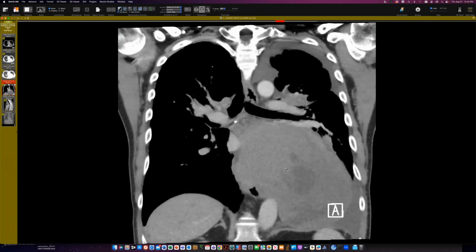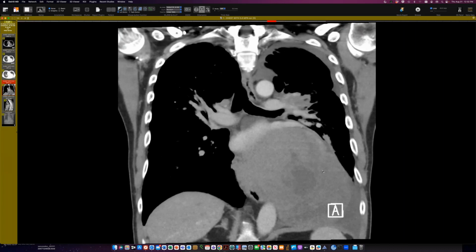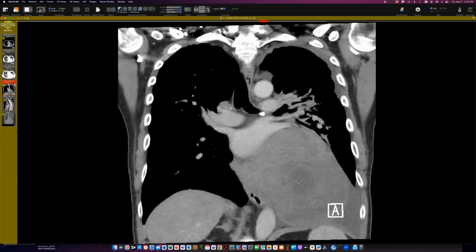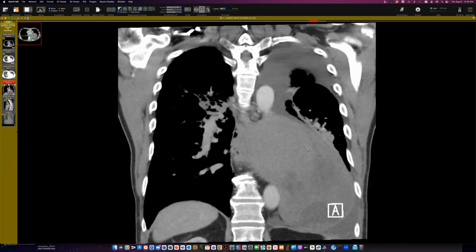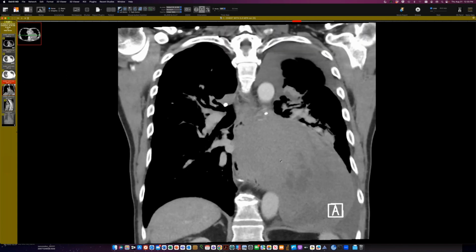There is not an excessive number of mitoses. I guess the cells are fairly uniform. On the biopsy, they didn't find any necrosis, but the biopsy is just a small sample, and it looks to me as if there probably is some necrosis given the low attenuation components to this thing. So inhomogeneity and pleural effusions are signs that make you worry that this could be one of the malignant versions of solitary fibrous tumor. So far, we don't have that, but when this lesion is finally resected, then we'll have more tissue to look at, and they can look harder to see if there are any signs of malignancy in parts of this lesion. So a very large solitary fibrous tumor.